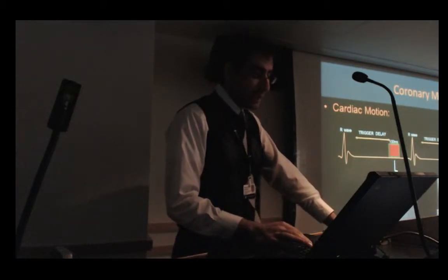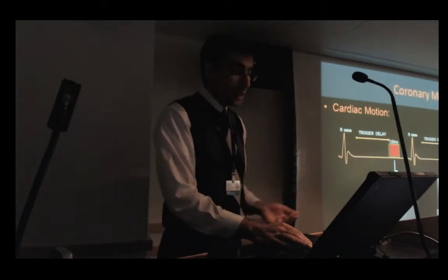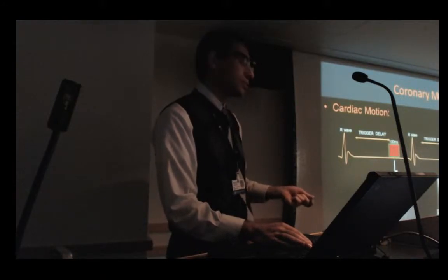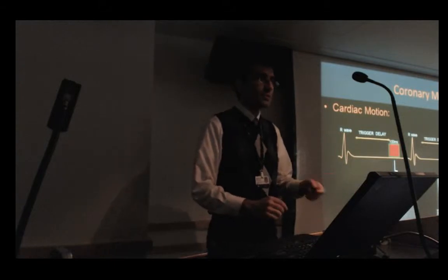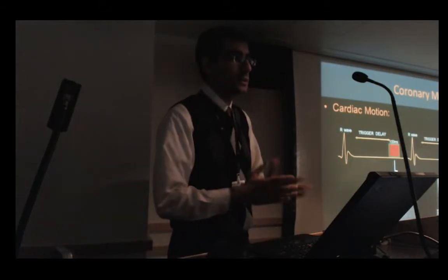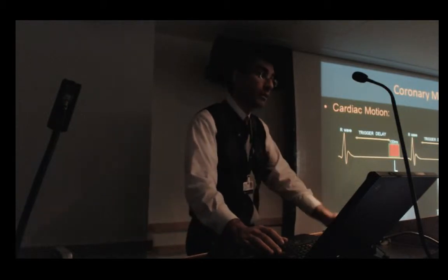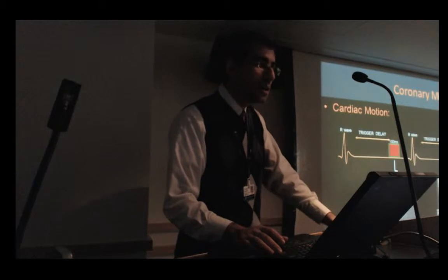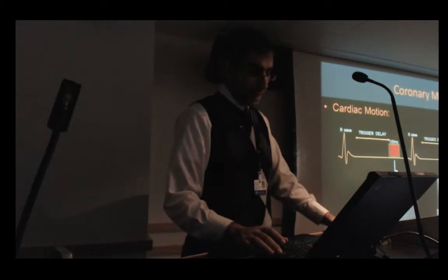Again, that means that if I have 90 times 256 k-space lines to acquire and only acquire 20 k-space lines per cardiac cycle, I need around 1200 heartbeats, or cardiac cycles, to fill up my k-space data. That means around a 20 minute scan, which is very long, and we cannot have our children, for example, under anesthesia for 20 minutes under the scan. So the problem is more than that.